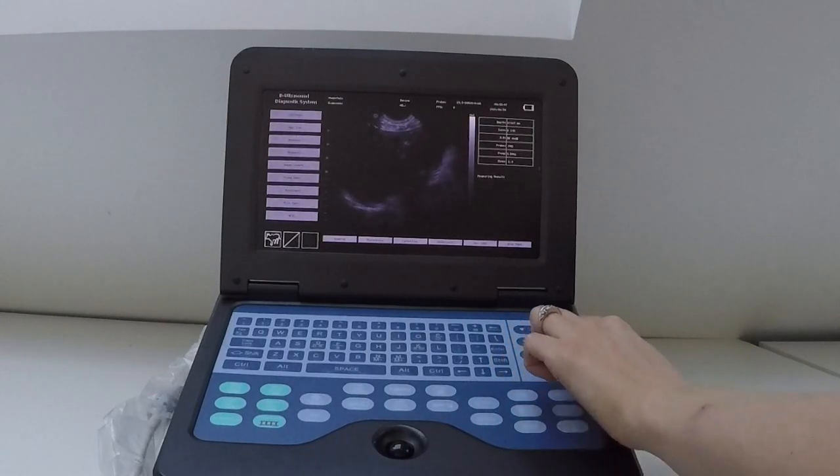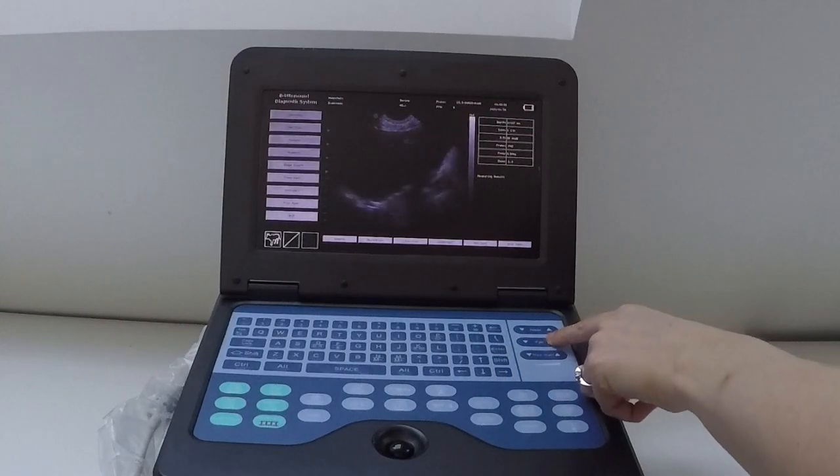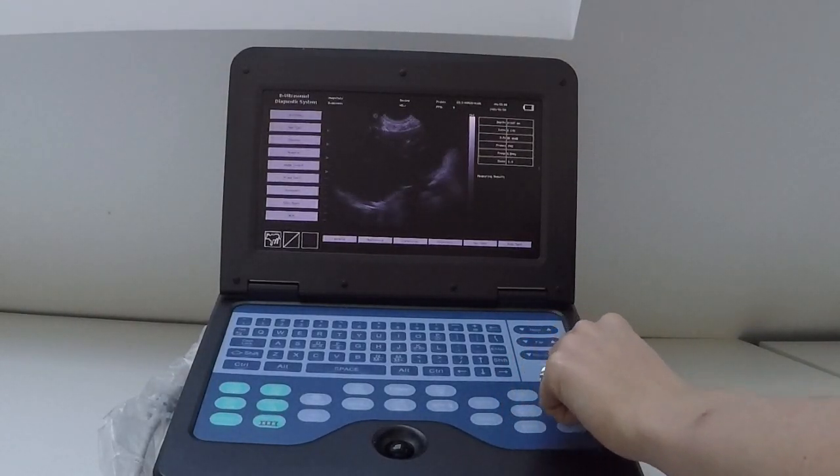You've also got a near and a far gain. Near means the near field, which is the top half of your screen; far means the far field, the bottom half of your screen. You rarely would need to adjust those individually — most of the time you're going to be using your main overall gain.